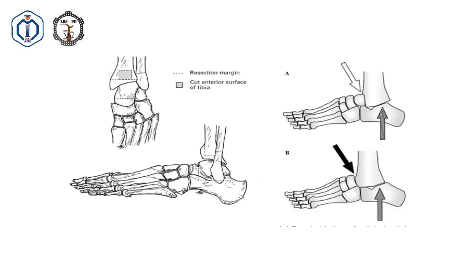Here is the resected part, this is before and this is after. Here the L-shaped distal end of the tibia is matching with the remnant of the talus.